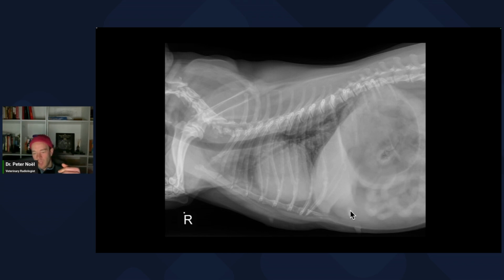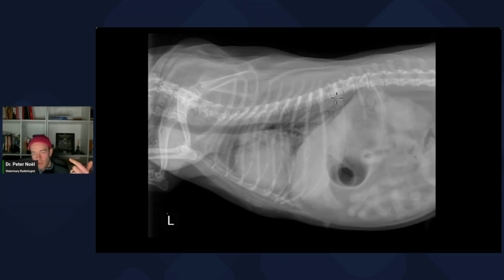A little bit too much here. I think it's a little bit too much liver. I don't know, his gastric axis is fine. It just looks a little swollen. This is an abnormal lung pattern. This is an area that's often overinterpreted because the patients are expiratory and obese, but this is a real, I think, lung pattern. He's also rotated. I think that there's a real lung pattern.